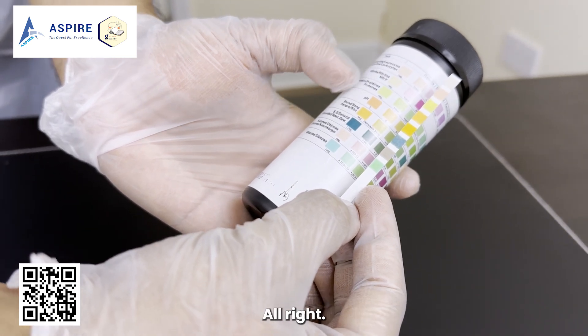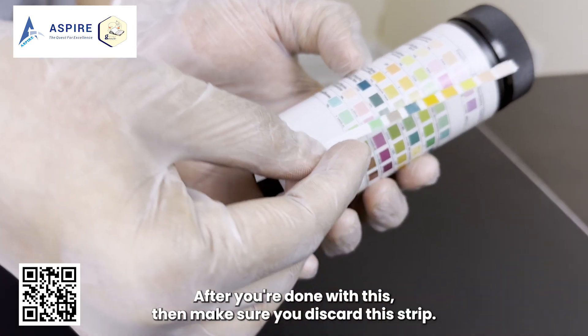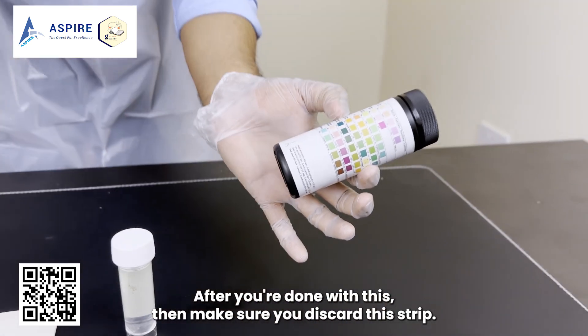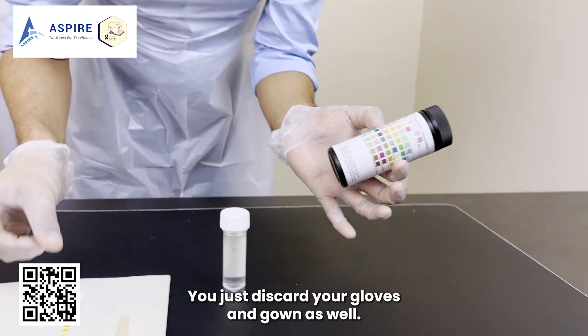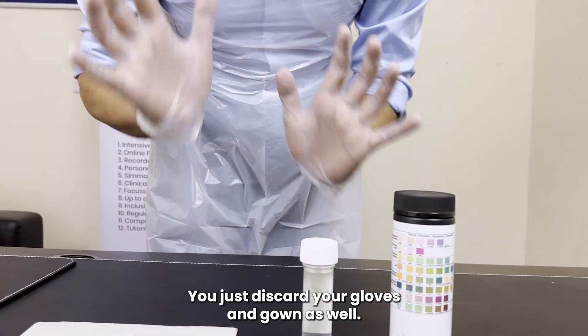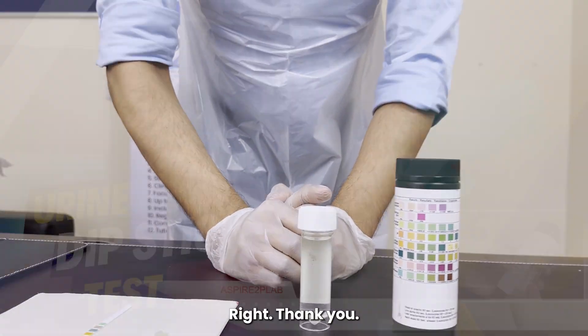After you are done, discard the strip, then discard your gloves and gown as well. Thank you.